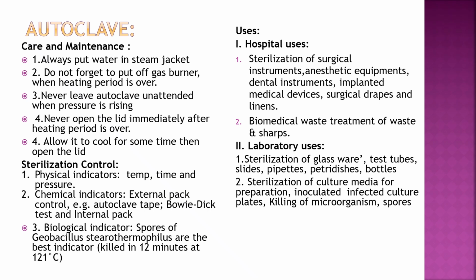The biological indicator, spores of Geobacillus stearothermophilus, is the best indicator, as its spores are killed in 12 minutes at 121 degrees Celsius. Uses of autoclave: there are mainly two uses, hospital uses and laboratory uses.